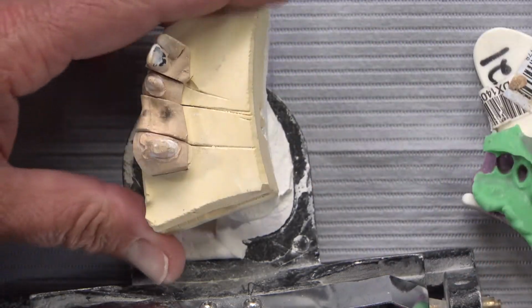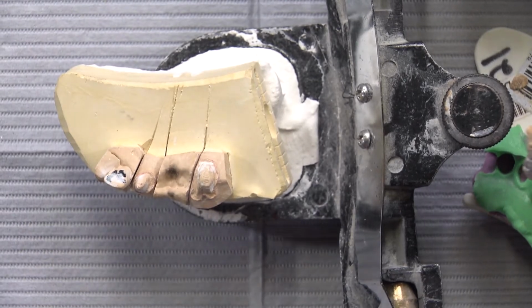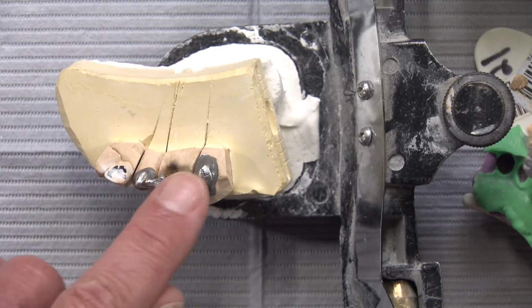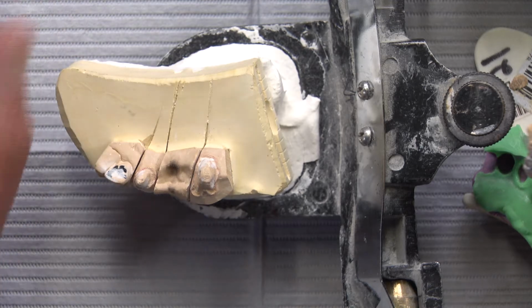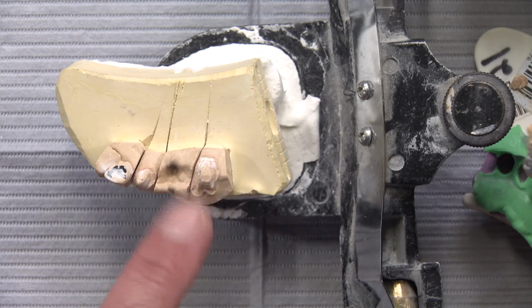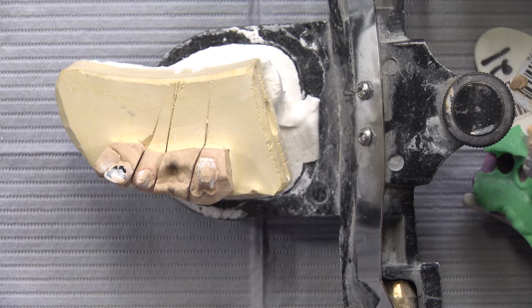You know, we can trim the dies and make the bridge fit, and I suppose we could send a metal framework to the doctor and have him do the bite that way, but we want a tripod. We want to be able to have the bite registration here. Ideally, what we would have is a full upper impression, full lower impression, and a bite registration squirted here and here, literally just on the occlusal third of these preparations, and then on the occlusal third of the teeth across from it.